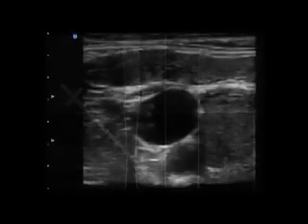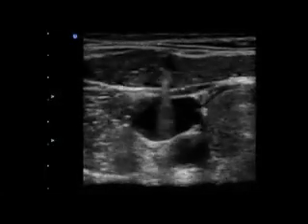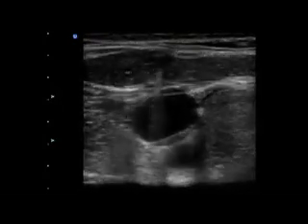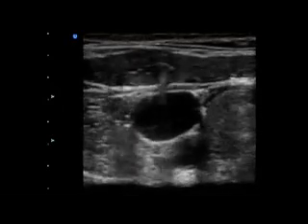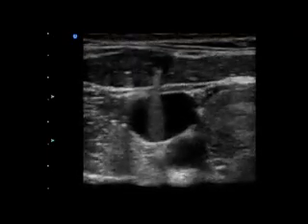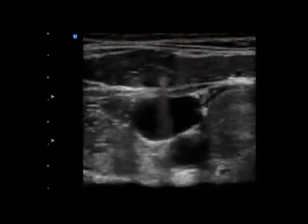With the transverse approach, the needle passes diagonally through the ultrasound plane and appears as a single bright echogenic focus on the ultrasound image. The needle is very echogenic and produces a ring-down artifact and shadowing. Beginners may mistake the ring-down artifact and shadowing for part of the needle. It is important to realize that the needle tip is not usually visualized in the transverse plane. This can lead to errors in depth perception of the needle tip and injury to structures deep to the vein.